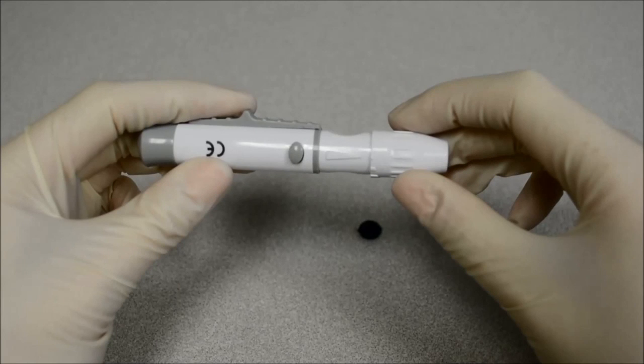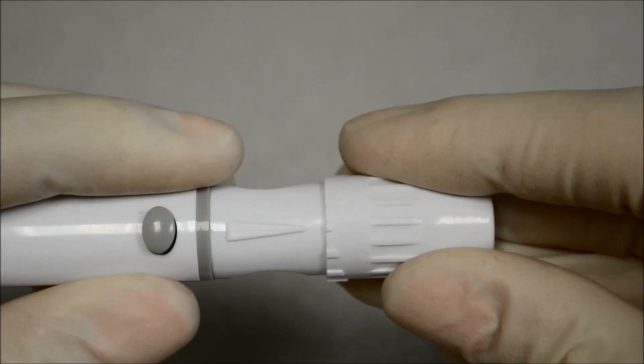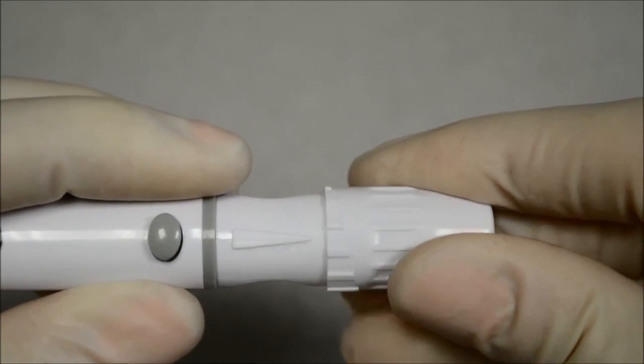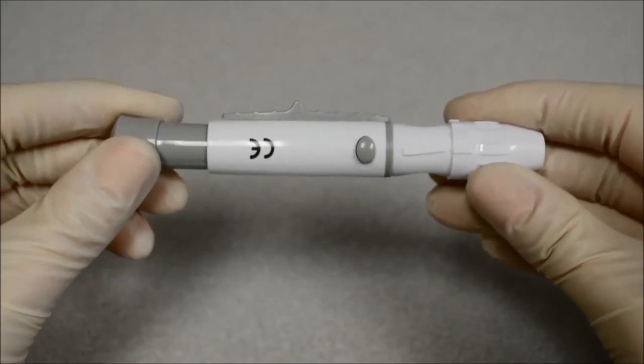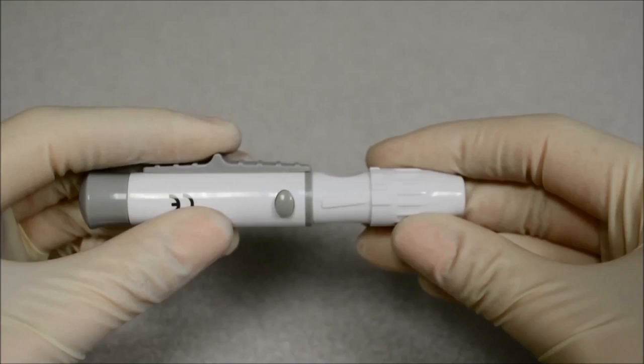Make sure the cover is fully seated on the lancing device. Adjust the puncture depth by rotating the lancing device cover; there are a total of six puncture depth settings. To reduce discomfort, use the lowest setting that still produces an adequate drop of blood. Use settings 1 and 2 for delicate skin, 3 and 4 for normal skin, or 5 and 6 for calloused or thick skin. Pull the cocking barrel back to set the lancing device — a click may be heard. The device is now loaded and ready to obtain a drop of blood.